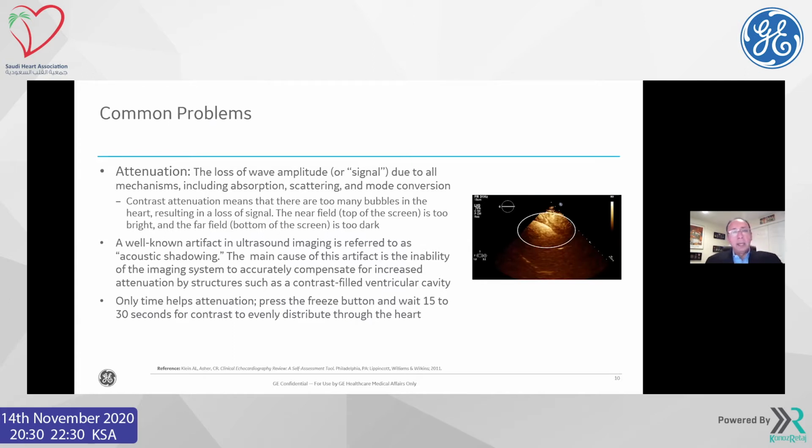And one is your equipment settings. The other one is your dosing and your administering. So when you inject, administration is very important. The key to administration is to inject very slowly. If not, you will get attenuation. And that's what this picture is showing here.